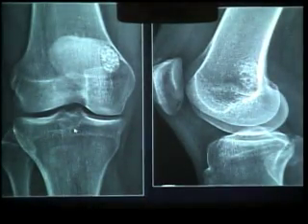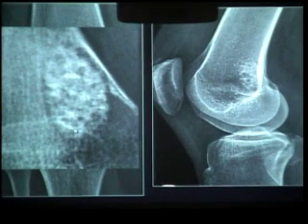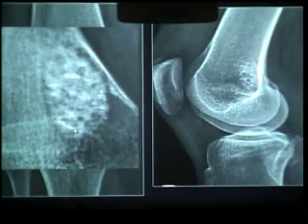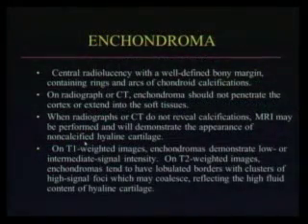And this is very important. This is the typical pattern that we see when we are reading MRIs of the knee. We see those all the time. So you will see the chondroid matrix as rings and arcs. Maybe you have an arc here and a lot of rings. And you don't have sclerotic margin. This is very important. The absence of sclerotic margins will differentiate an enchondroma from what? Usually the radiologists put both in the differential diagnosis. Say, this may represent an enchondroma or bone infarct. Usually it's not tough to make the differentiation between both, okay? Because of the sclerotic margins.